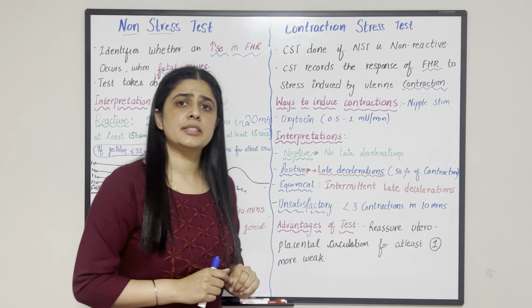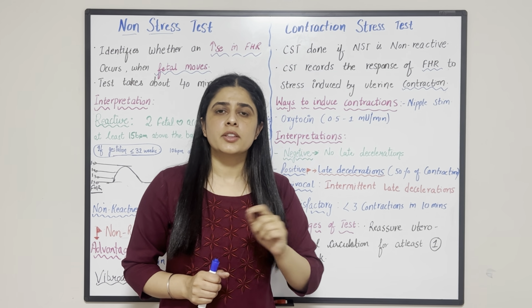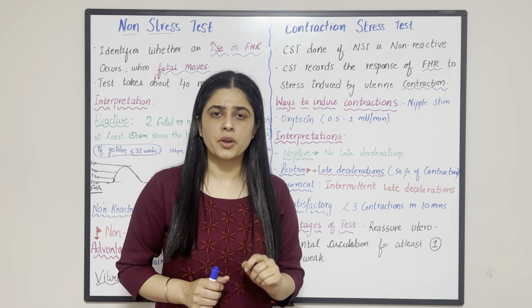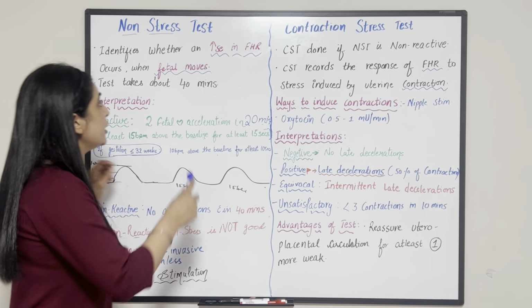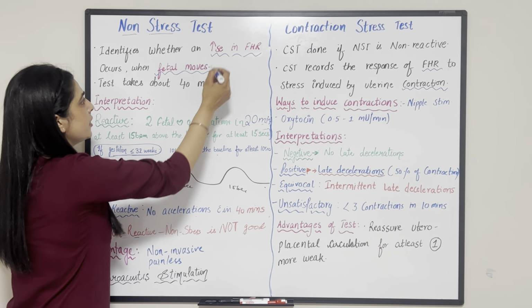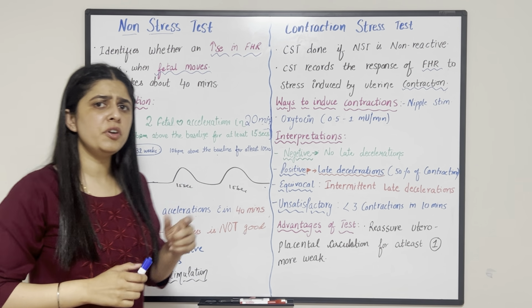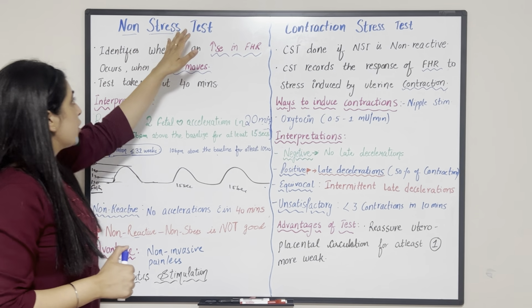How do we do this test? When mothers come in, we put the mother on the external fetal monitor, and we observe whether the fetal heart rate increases when the fetus moves in the intrauterine cavity. So how do we interpret the non-stress test?